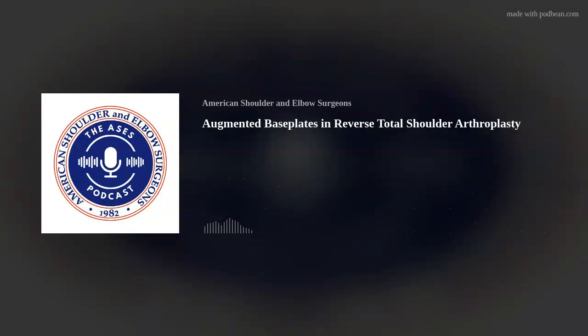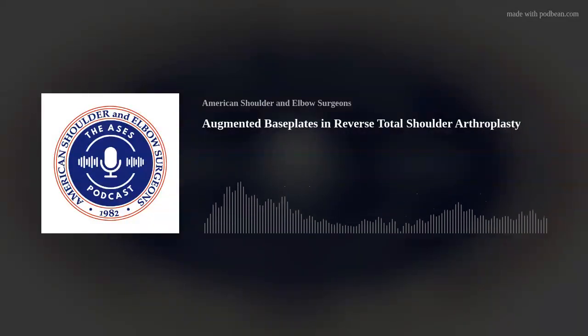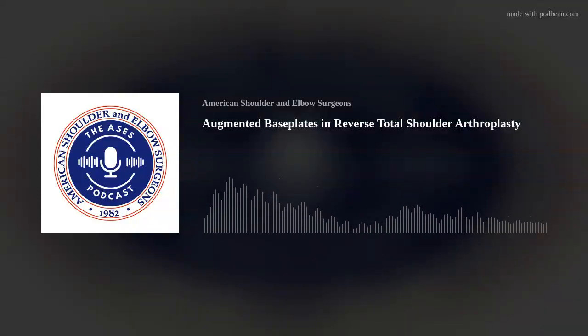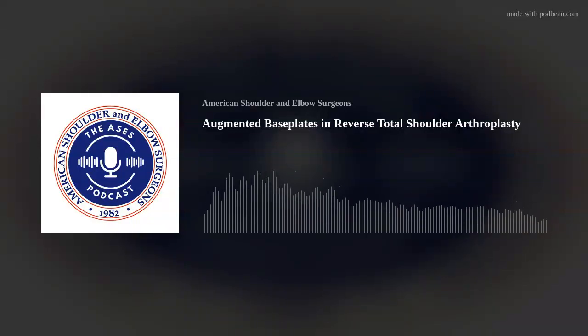patient population. So just to be clear, Brian, we're dealing with a patient who's had an arthroplasty. It's a hemiarthroplasty, and we're converting them to potentially a reverse. Is that right? That's right. And they've had erosive changes in their glenoid that are pretty significant, and most of the off-the-shelf components are probably going to be suboptimal for some of the defects here.